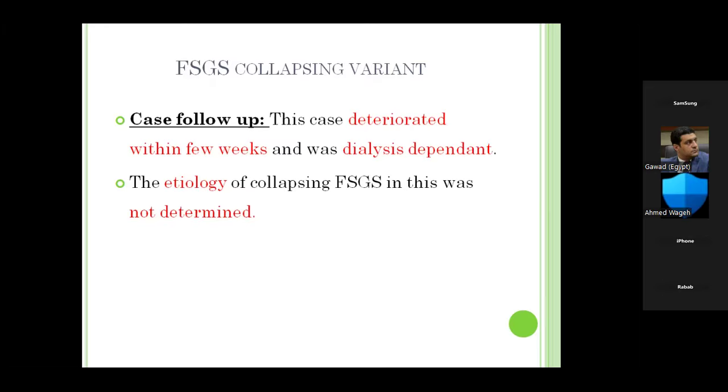Okay, am I clear? Yes, we have a question from Dr. Abdullah. Collapsing mimic crescent. I can reformat the question. Yes, I will reformat the question. How to differentiate between a pseudocrescent and a true crescent?